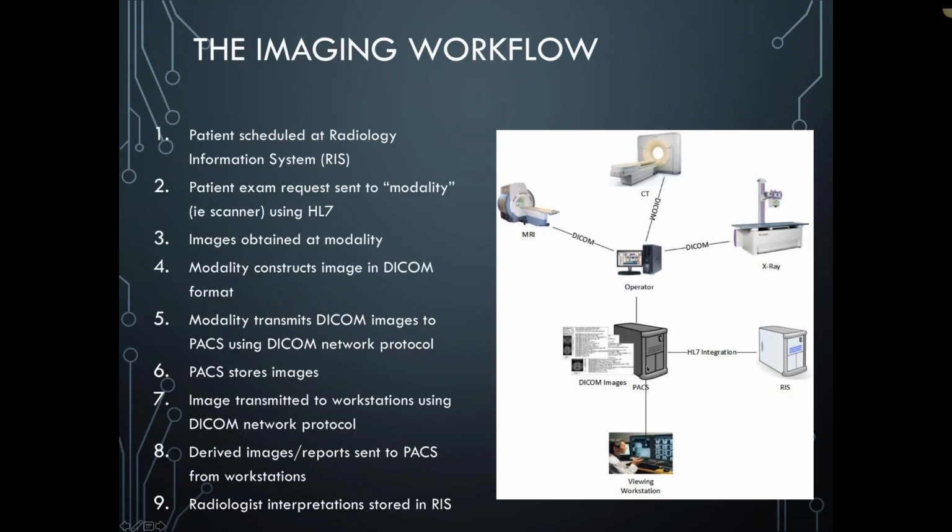So this is like the big image database. When a clinician is ready to view the images, they're transferred to a viewing workstation over the DICOM network protocol. And it's at the workstation where the radiologist does his interpretation, and the results of that interpretation are sent typically back to the PACS and the RIS systems.